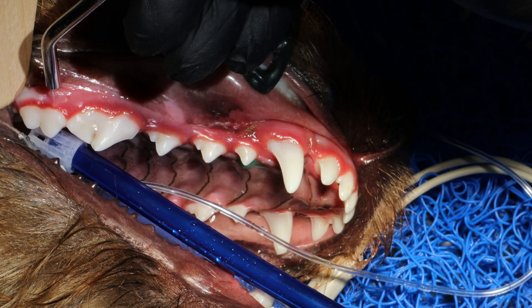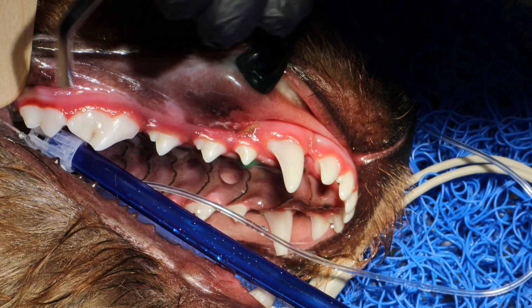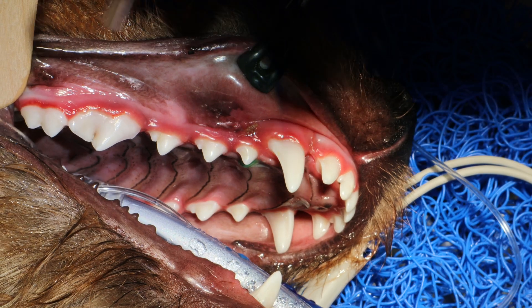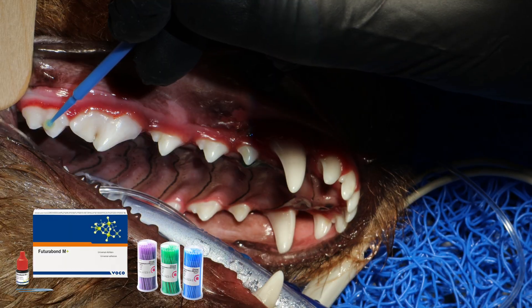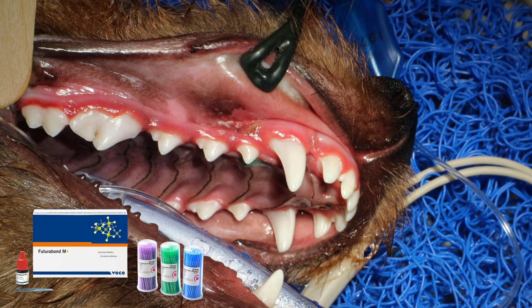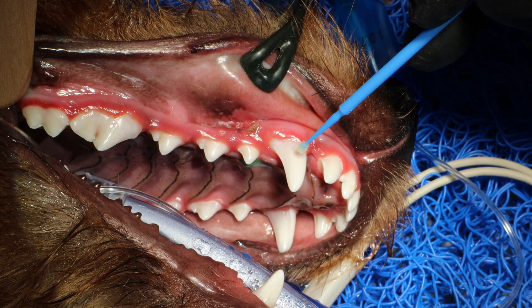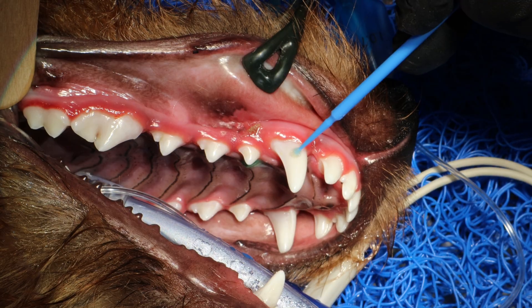I'm flushing again for 20 seconds, and just a light drying with my air syringe. Now I'm applying a bonding material — this is called Futura Bond M Plus. You can get them in single-use packages, but you can also get a bottle like this. I would recommend the bottle because it lasts much longer — you get at least 100 treatments from that.